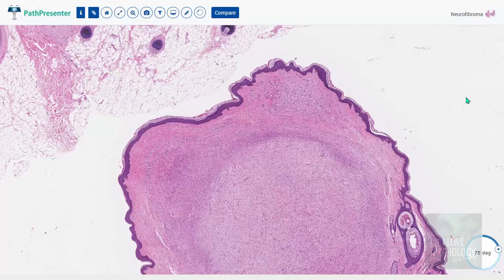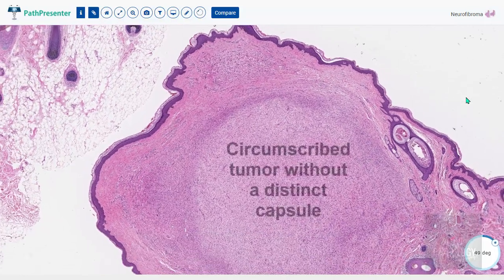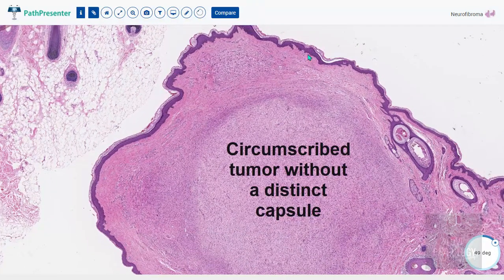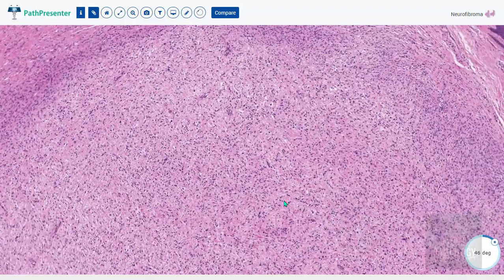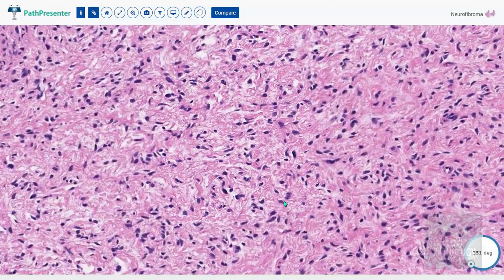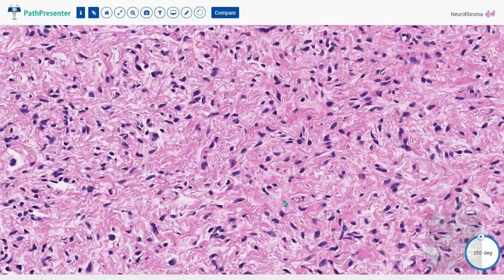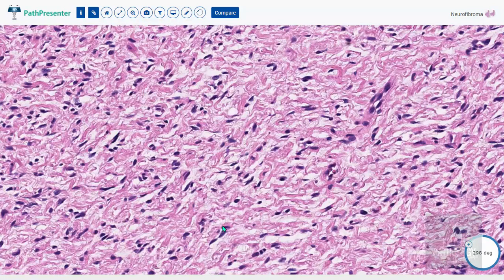Let's understand neurofibroma microscopically by this virtual slide. This is an elevated lesion or nodule on the skin. At scanner magnification you can make out it is a circumscribed tumor without a capsule, located in the dermis. On higher magnification you can see haphazard proliferation of spindle cells with elongated nuclei. Some of these cells have wavy nuclei, which you can appreciate here and there.